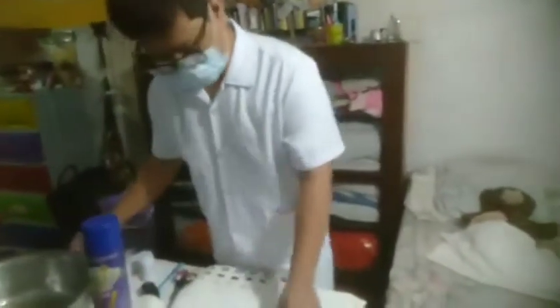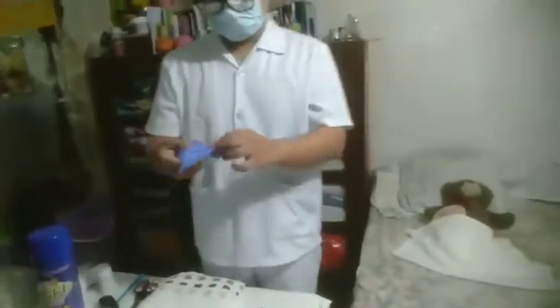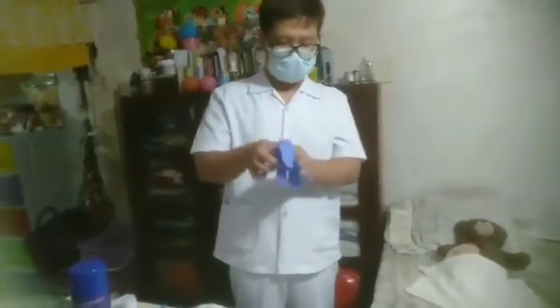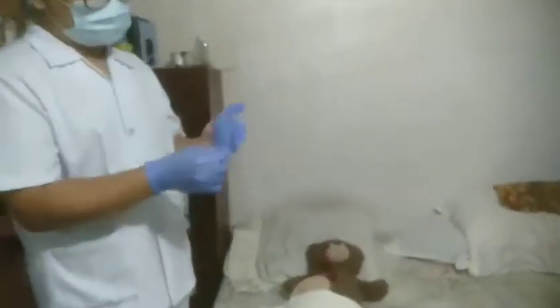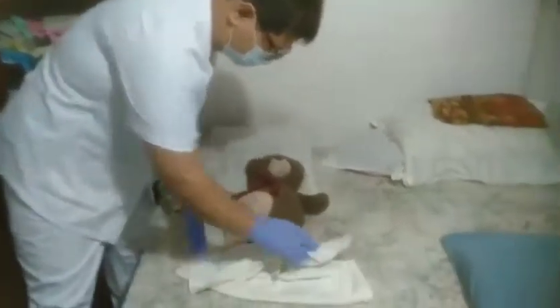Okay, then you can wash your hands now, apply clean gloves, and observe appropriate infection control procedures. And then make sure also, after you have put the gloves on your hands, to assist the client into a comfortable sitting or lying position in bed, or a sitting or standing position in the bathroom. If the client is doing it for themselves, position a mirror.